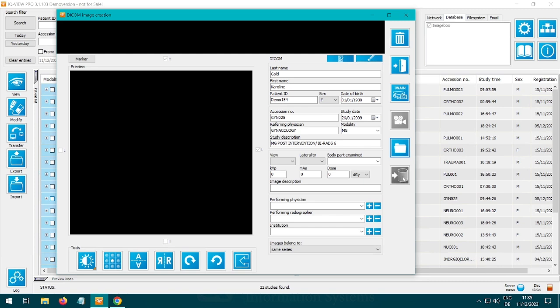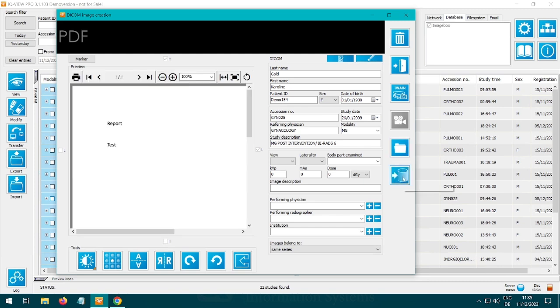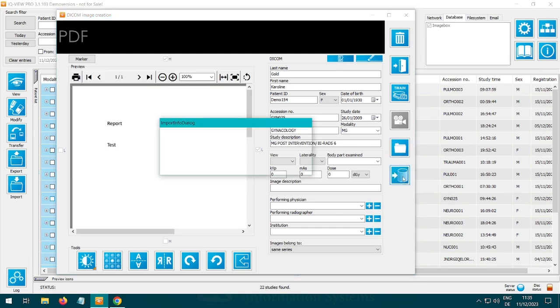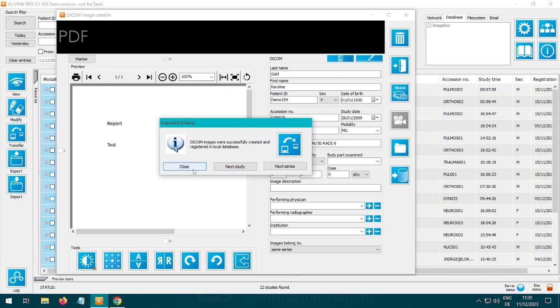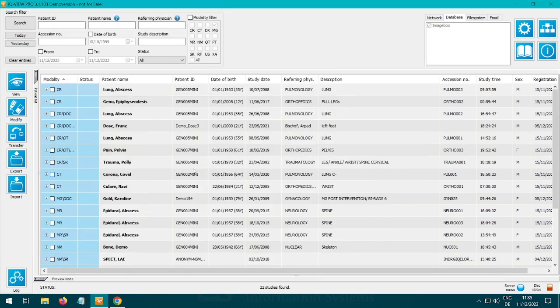Click on load into local database. Here you can decide whether to load the data as a new series, new study, or directly into the selected study by clicking close.